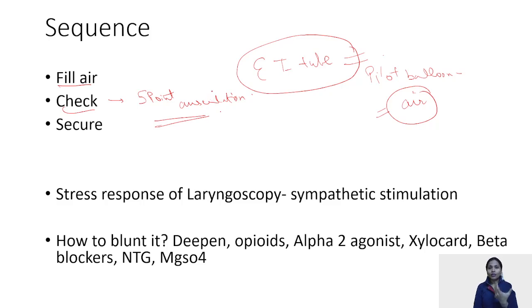Where do you actually see these 5 points? One is your gastric, two the upper part of your anterior thorax, and two at the axilla. 5-point auscultation is done. Then you can confirm whether the endotracheal tube is in situ or not. How do you confirm?